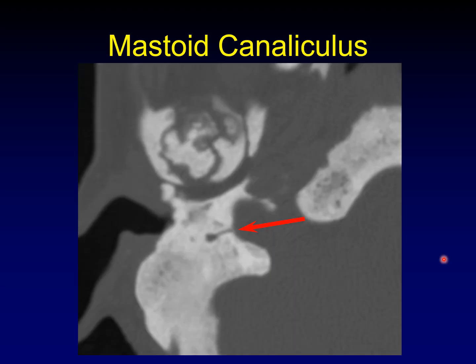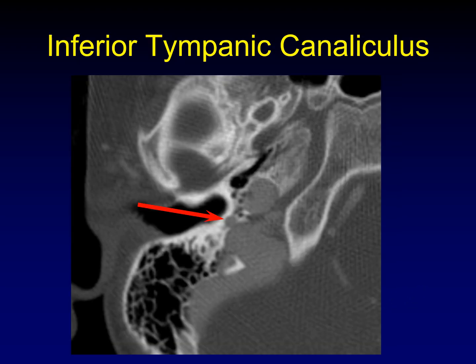Here's another very straight object. This one is running from the jugular bulb out to the mastoid segment of the facial nerve. We're about one centimeter above the stylomastoid foramen in this axial cut. This is the mastoid canaliculus. It carries Arnold's nerve.